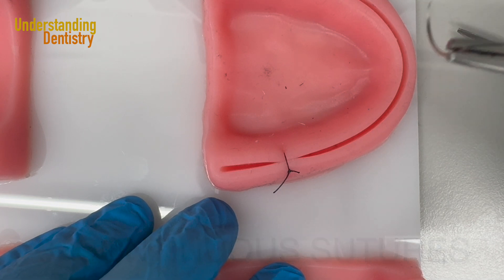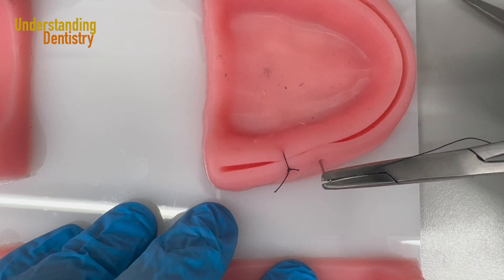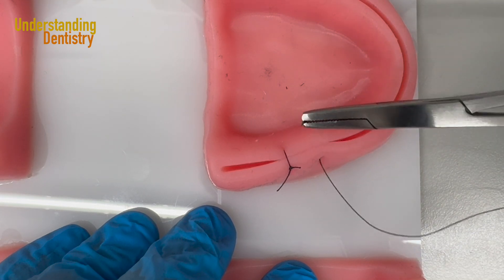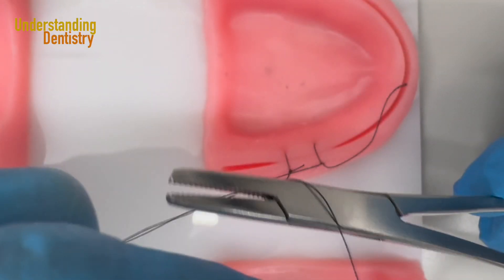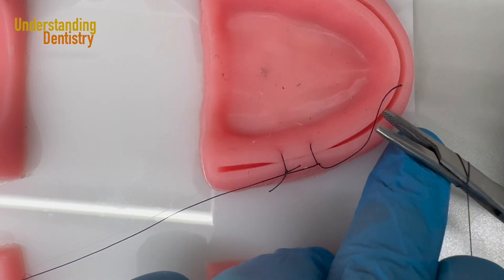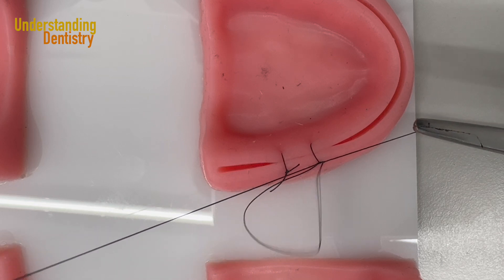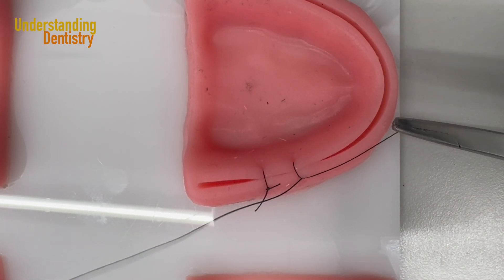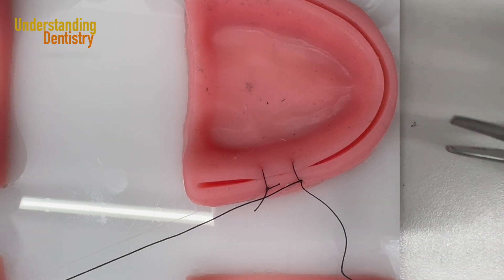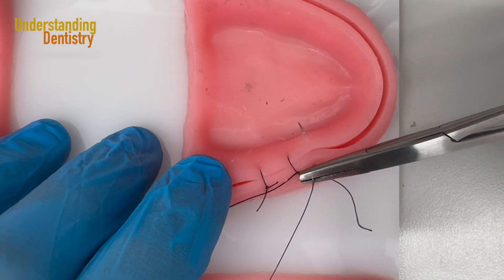For the continuous suture we are going to start with an interrupted suture. Again we do one single suture from buccal to lingual. I capture my needle again, lock the knot going the other way — counterclockwise. I hold the thread again and finish the suture. However, instead of cutting the suture I am going to continue as a continuous suturing procedure. I go from buccal to lingual.